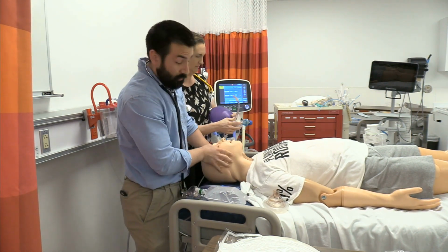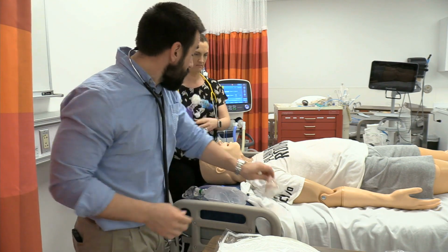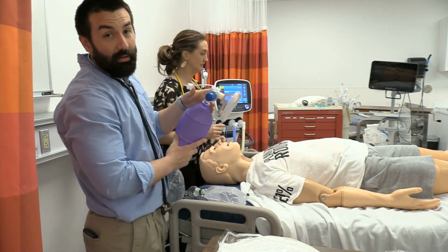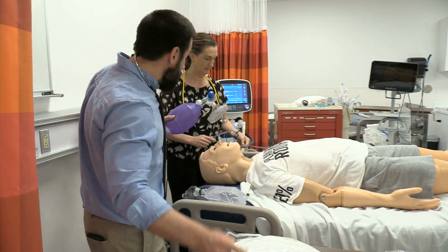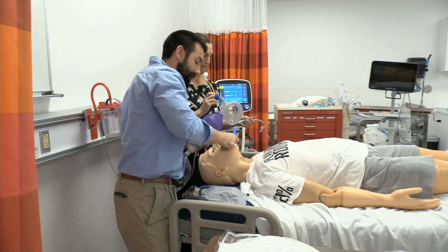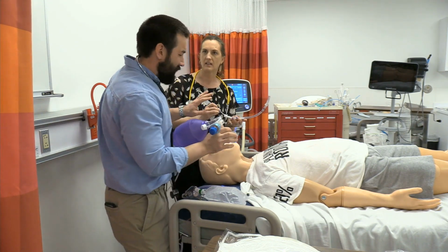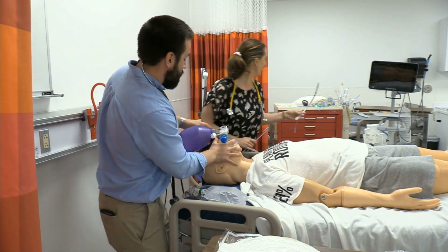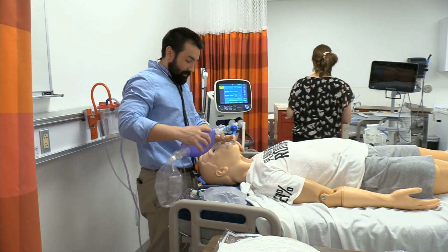Now, this patient is paralyzed and cannot breathe. Our saturations are probably beginning to fall. Oh no. That's why you need to make sure you've got your mask ready to roll. I'm going to prophylactically drop this oropharyngeal airway because I'm going to have to go grab some equipment here. I'm just going to put this tube back in. No, I'll grab you another one. Oh, nasty. Yeah, that is nasty. Do you want to go ahead and grab the tube and I'll take care of this? Sure.